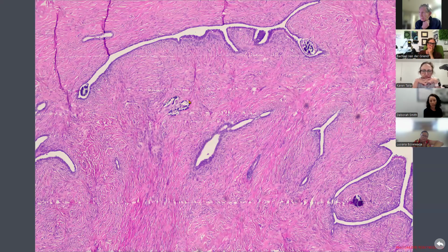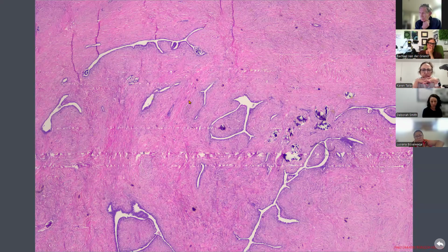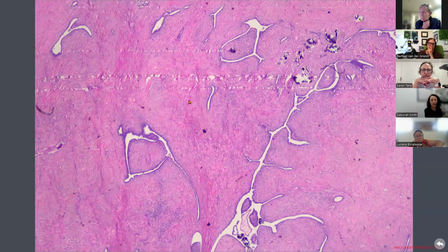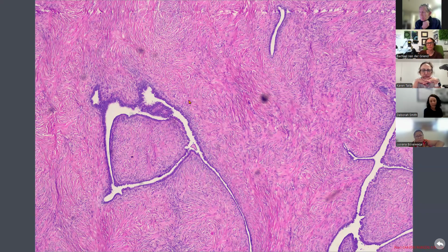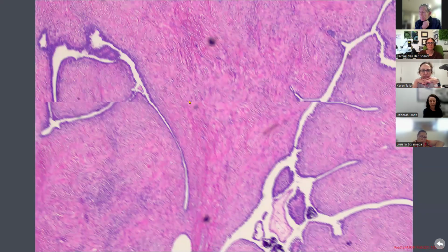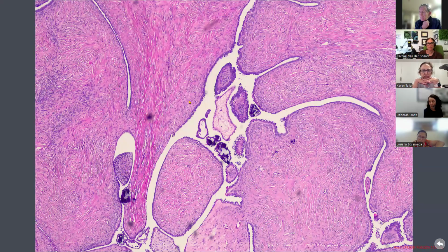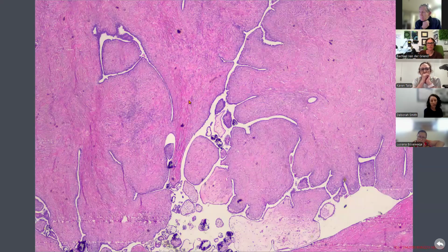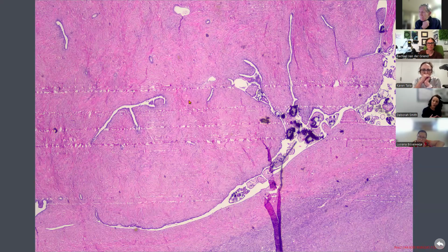So we're busy looking at this tumor and thinking about at what point do you push it upwards? Because the WHO rules allow a benign serous cystadenoma up to 10% epithelial proliferation. However, there is a caveat, which is nicely put in the current WHO, where it says except on the surface. So we were busy deciding, do we have 10% or not, across the whole tumor. And then it came out that actually this whole thing was related to the surface.